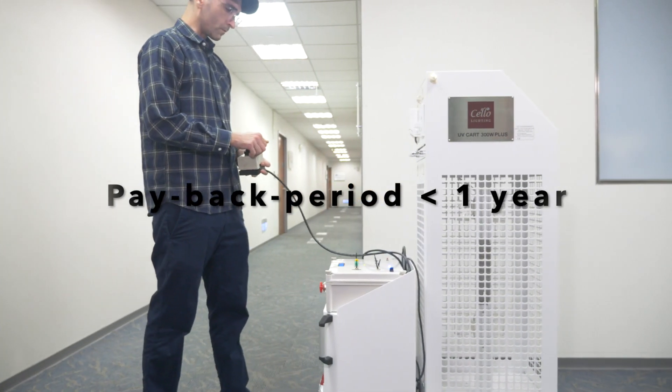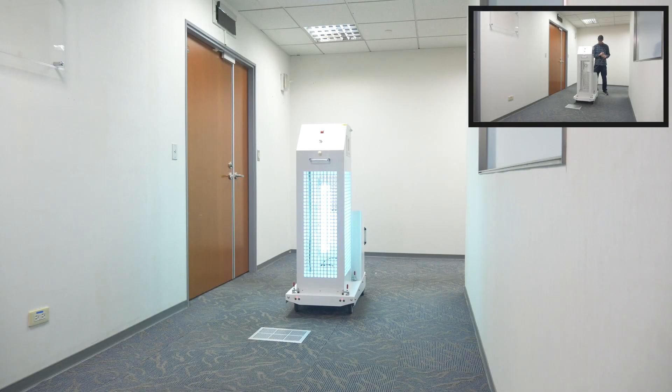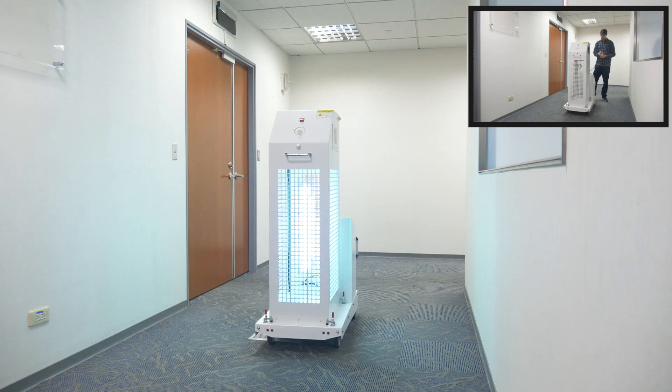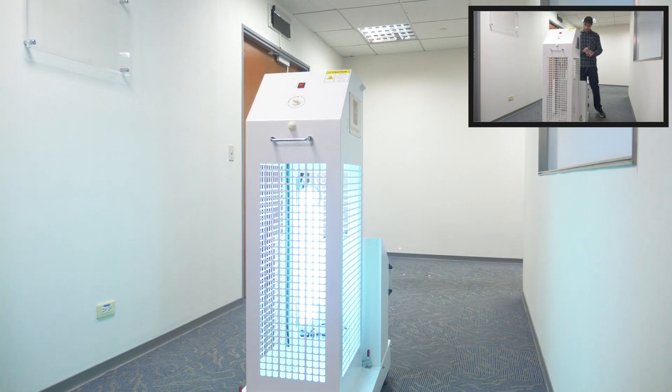Besides, users do not need to learn any software. They can use the included joystick to train the robot to navigate the desired route. After training once, the robot will memorize this navigation plan and can repeat the same route from the same starting point every day.